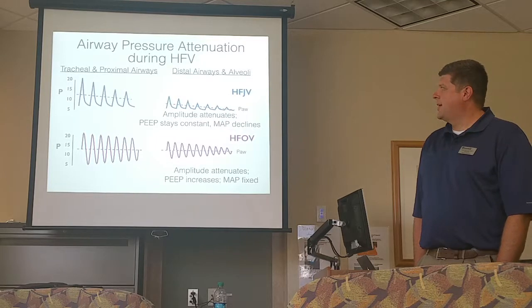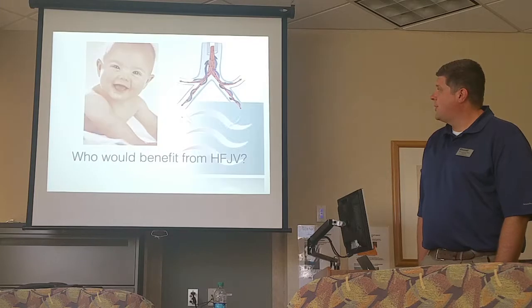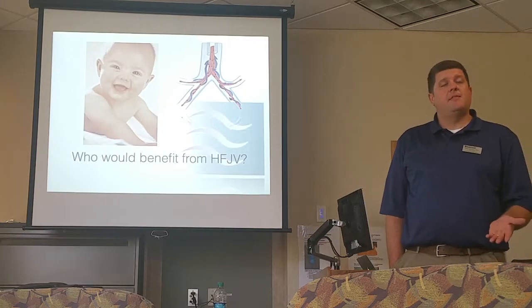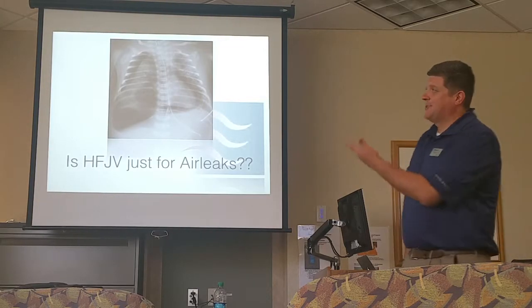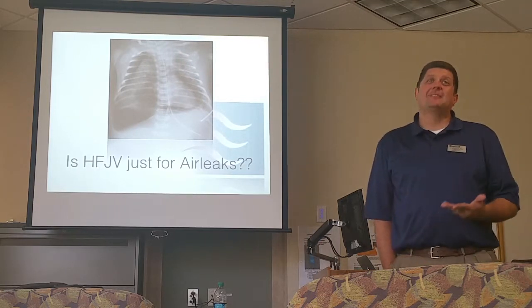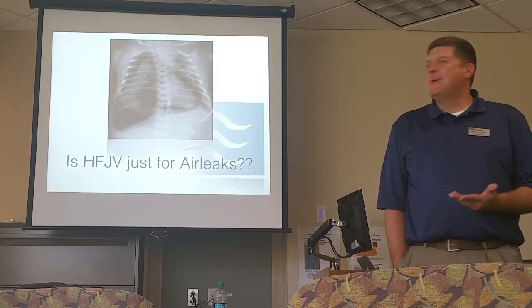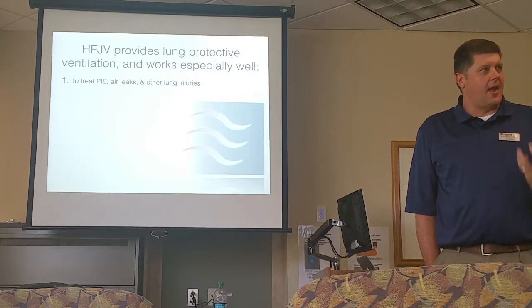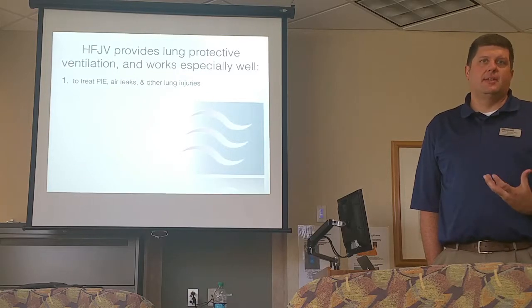There. But when it comes to certain disease processes, they really are different machines, and why one may make a difference versus the other. So who then would really benefit from being on a jet? Is it just for air leaks? Is it just for an x-ray that looks like that with all that gas over there? Well, if this is your x-ray, I hope that kid's already on a jet, and I hope we get the chest tube tray out, okay? But by far and away, kids with established PIE, air leaks, gross overinflation, these are jet kids, okay?